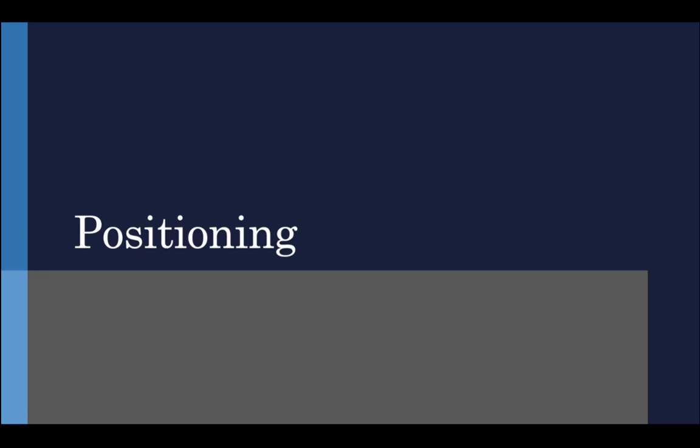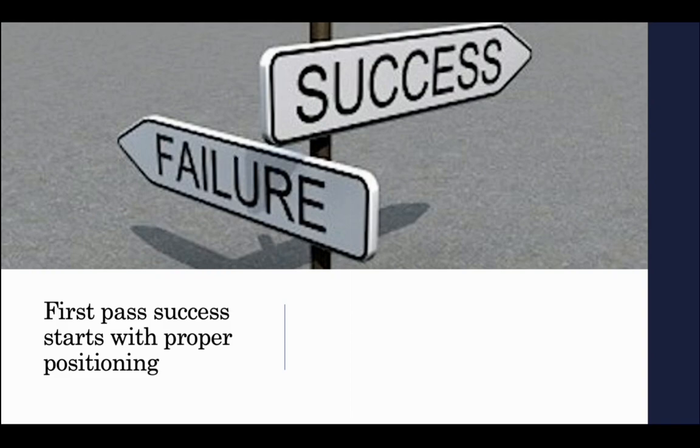Positioning. By far and away, proper positioning is the most important thing to set you up for success. So we're going to think about the position of the provider, you, and the patient. Are they on the floor, or can I move them onto a gurney? Some dynamic positioning techniques we'll talk about, and this is positioning that happens during the intubation attempt, an effort between you and your airway partner that helps manipulate the airway to have success on the first try.